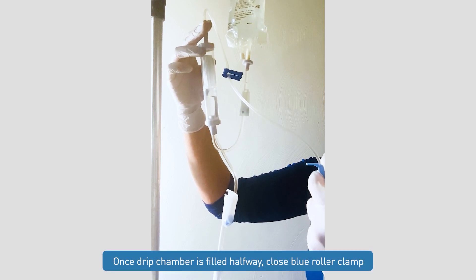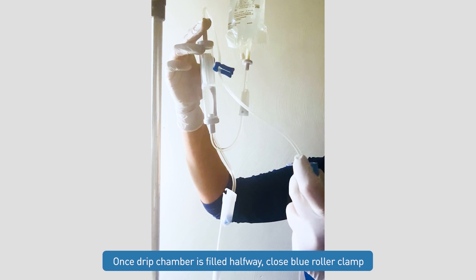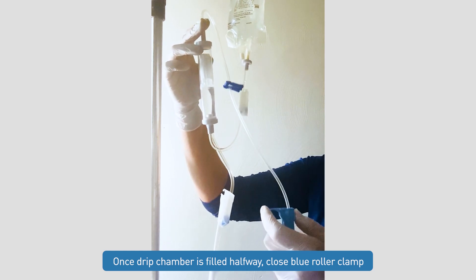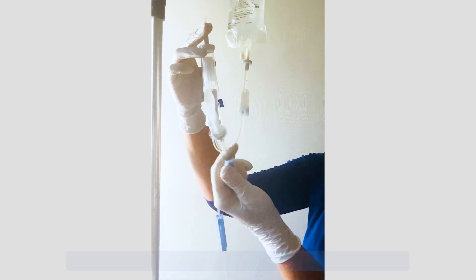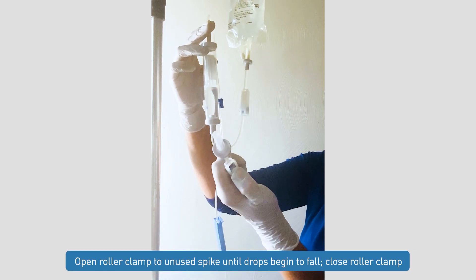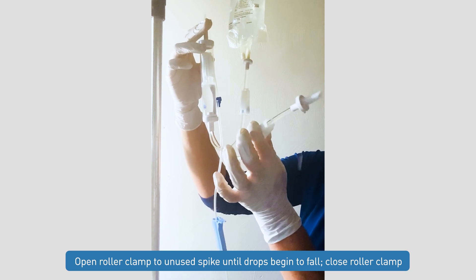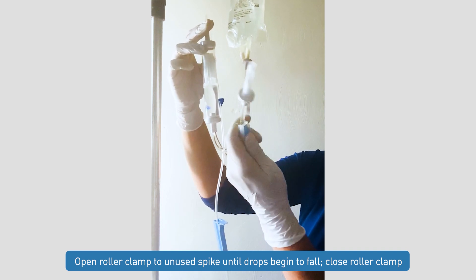Once this drip chamber is filled about halfway, we can go ahead and close our blue roller clamp. At this point, we will open our unused spike and allow that to prime until we have drops falling, and then we can close that roller clamp.